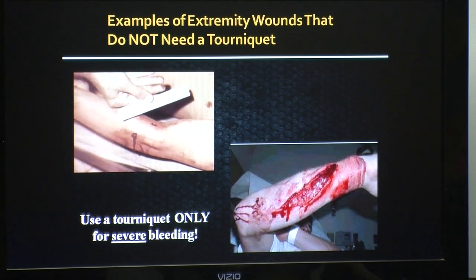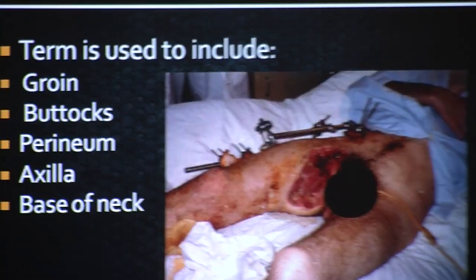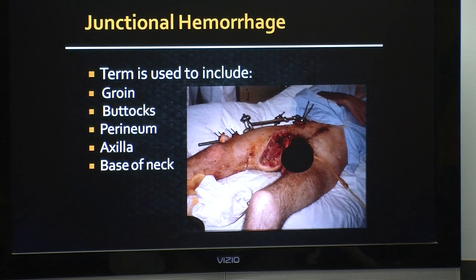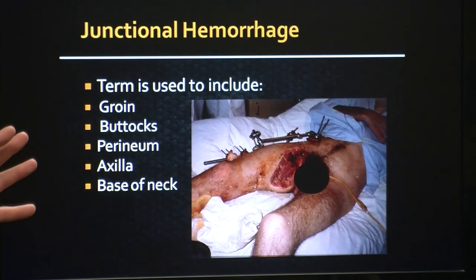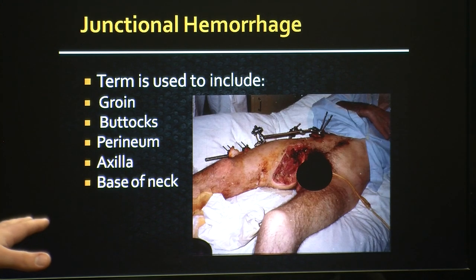Just some examples of stuff I don't need a tourniquet for. Okay, that can be controlled by direct pressure or the Israeli bandaging. Junctional hemorrhaging. What would worry me more than having to use a tourniquet is trying to stop something like this in an area I can't put the tourniquet.